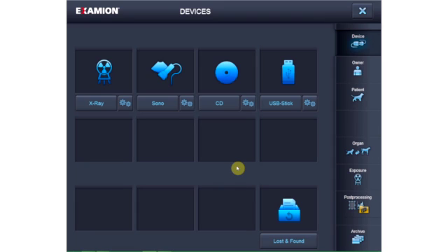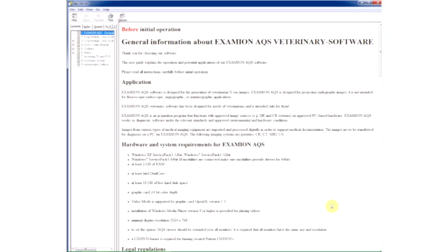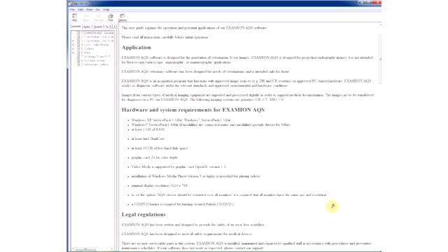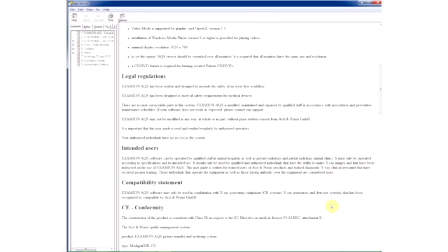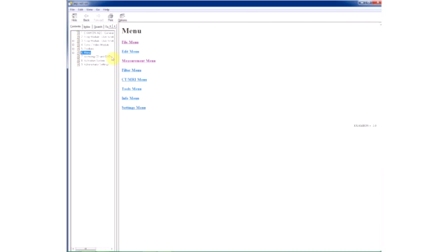To exit the Examion AQS software, simply click the X button and confirm the question to end the program with Yes. You can access the online help for the Examion AQS software from this screen. It supports you when you have questions and allows you to deepen and broaden your knowledge of the software.